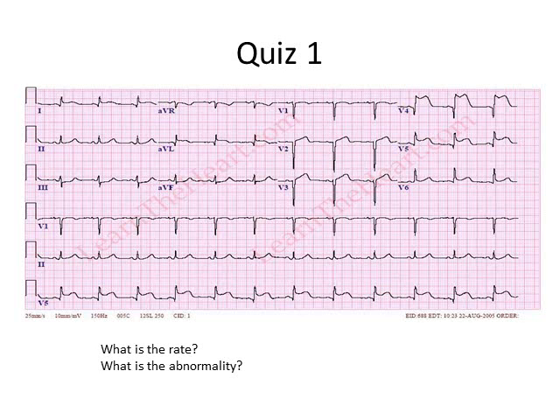Okay, so if we quickly go through the answers to the quiz, that's everything in terms of the lecture. What's the rate here? Just shout out the answers. 72? 72, that's very accurate. Yeah, about 75. And what's the abnormality? Yeah, ST elevation where? Yeah, there you go.